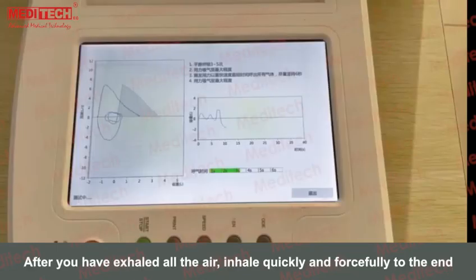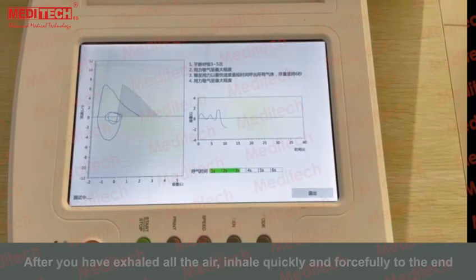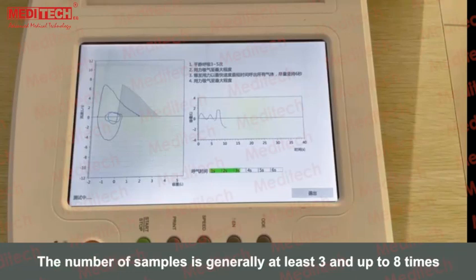After you have exhaled all the air, inhale quickly and forcefully to the end. The number of samples is generally at least 3 and up to 8 times.